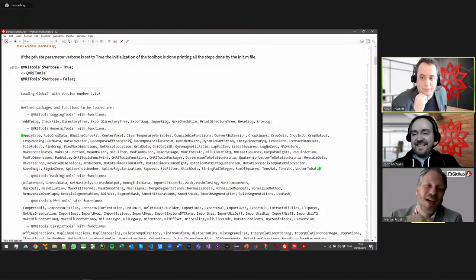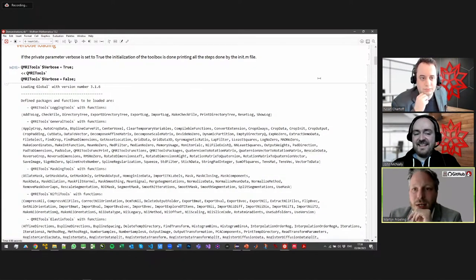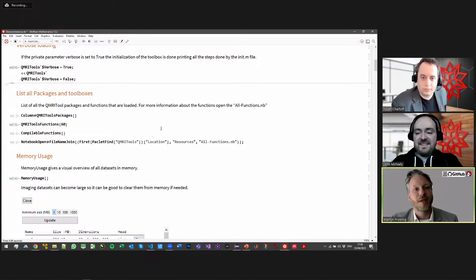For these kinds of demonstration notebooks, where you can highlight or show what's going on with coding with simple examples, I think is quite important. So this notebook is also made specifically for that. It shows low-level functionality, just as documentation does in the Wolfram language, to show and highlight what's possible. But if you want to do something new or special with it, of course, you have to think for yourself. So I use this a lot to show them, like I'm doing with you now, demonstrations of what the capabilities are.